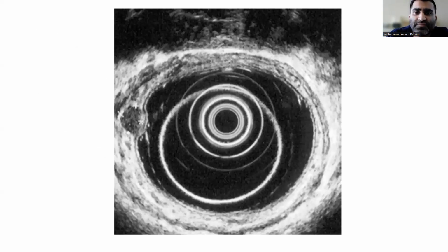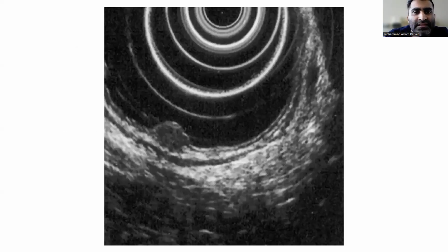So just some things on the picture over here. If you were to go in endoscopically, you'd see really the tip of the iceberg and miss the lesion, which is going so deep there. And again here, you're sort of only seeing the tip of the iceberg. The lesion is going much deeper than you would see endoscopically.